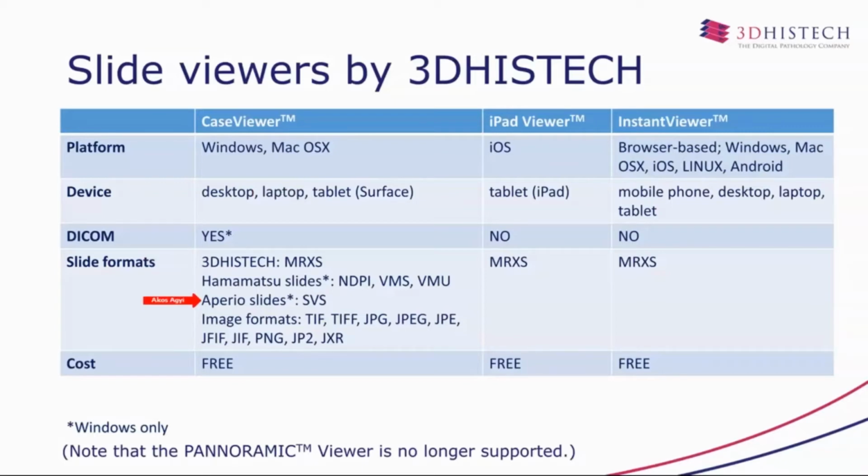The iPad viewer is available only for iOS devices and can open our digital slide format. And basically the instant viewer, it's available for a wide range of devices. Practically, you can use it on mobile phones, desktops, laptops, and tablets, and can open our own digital slide format.